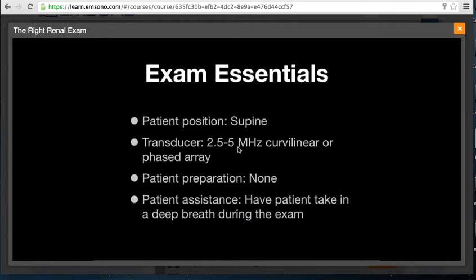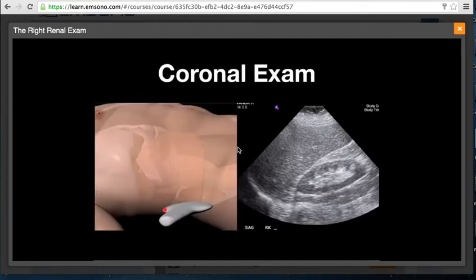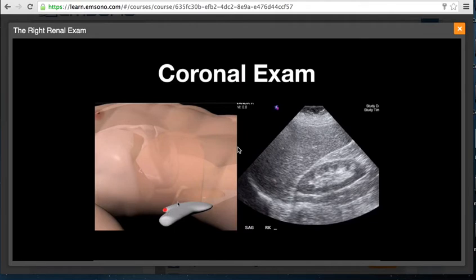The right kidney is scanned in both the coronal and transverse planes. The exam can be initiated in the supine position, with the patient turned into the left lateral decubitus position as needed. The transducer is placed just inferior to the right costal margin at approximately the mid-axillary line, with the indicator directed in a cephalad direction. If the kidney is not seen initially, gently angle the transducer anteriorly and posteriorly. If still not visualized, have the patient take a deep breath and hold it. Once identified, gently rotate the transducer until the kidney is seen in its coronal plane.